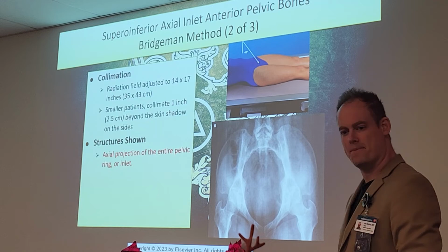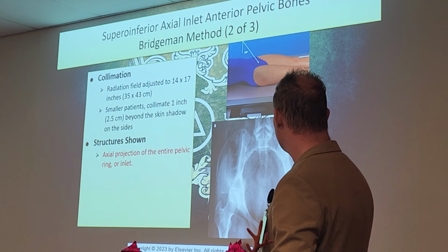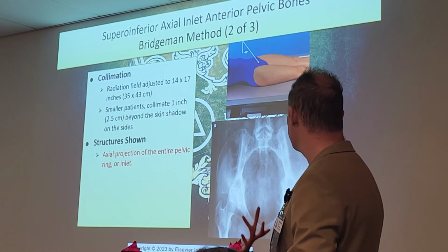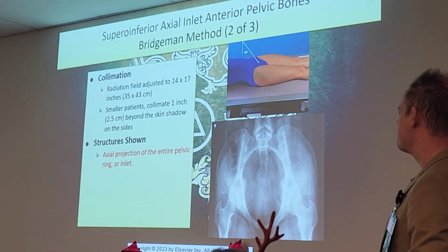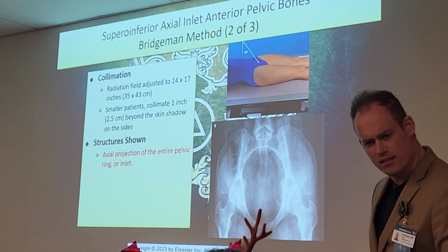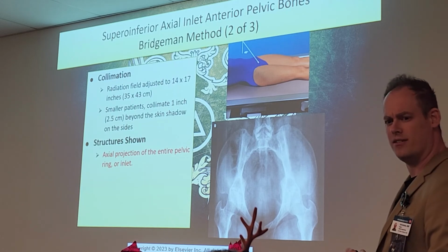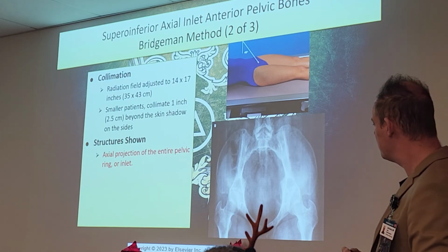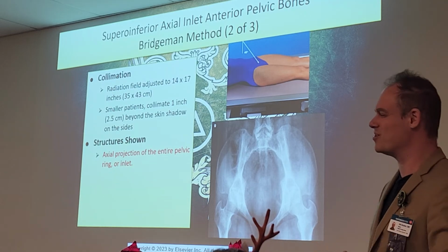It's a cool looking X-ray. Where's like the secret stuff? Sacrum is right here. Coccyx you can barely see. The inlet and all that looks like the Fat Man. Like the what? The Fat Man from Fallout? Yeah, kind of, but the actual nuke itself, from way back when. Oh, I see what you're saying now. Okay. Took me a second.